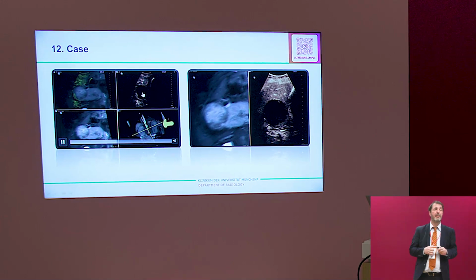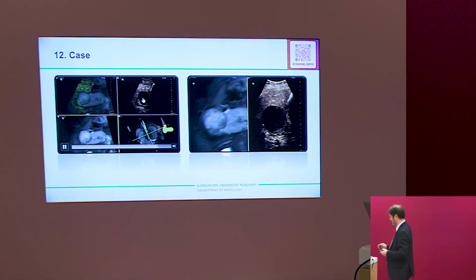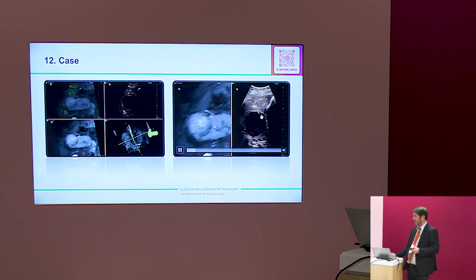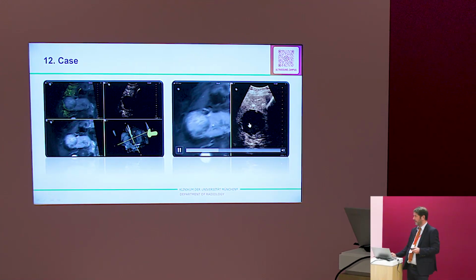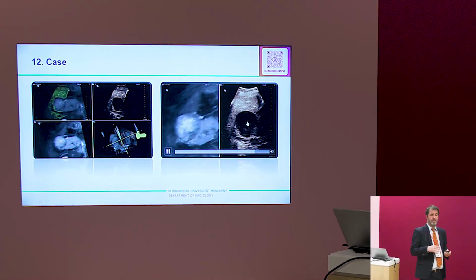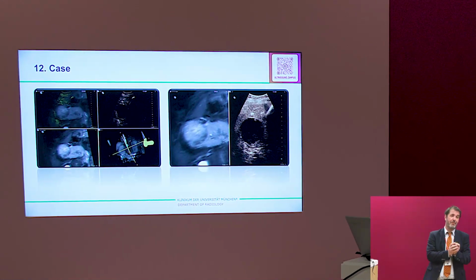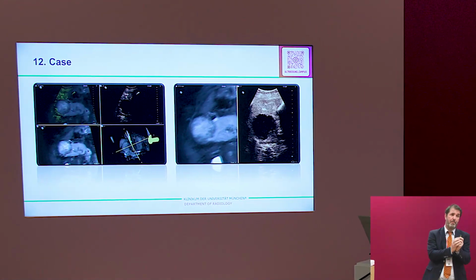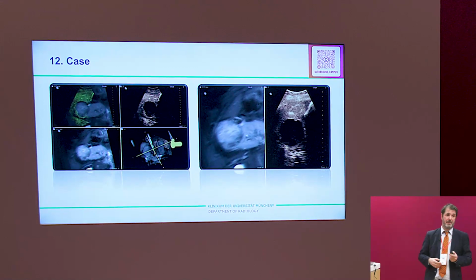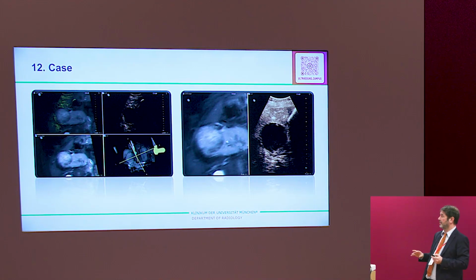We have uptake around. Yeah, but inside it's dark. It's not visible. Right? Yeah, but if you wait a little bit longer, it's a tricky case. You see here, bubbles, you see there? And also here, there, it's alive. This is a renal cell cancer, and most of the cancer have necrotic changes. That's the reason why most of them is black and not white in the contrast. That's the reason why they had also so much problems in the MRI. So papillary cancer, of course, this has to be removed.